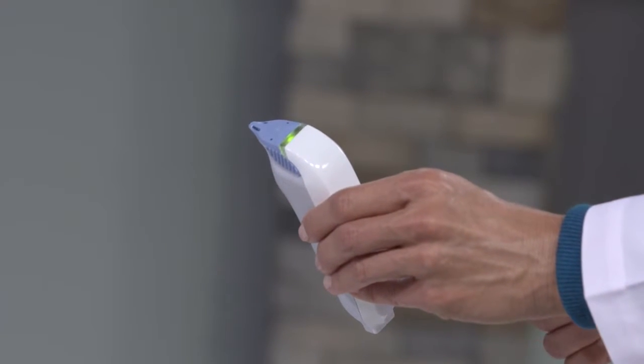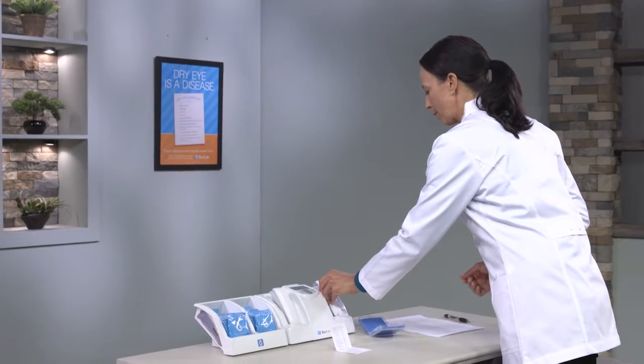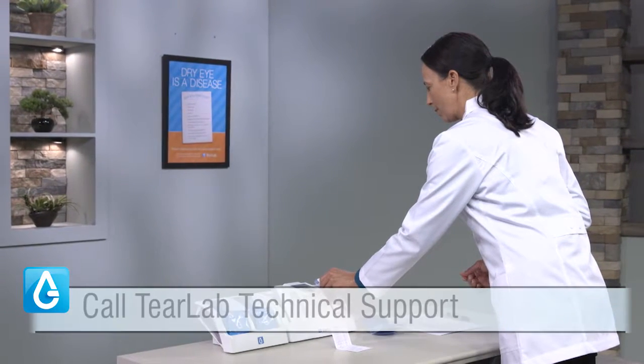If the error message continues to display on the screen or continues to occur over time, please call TearLab technical support.